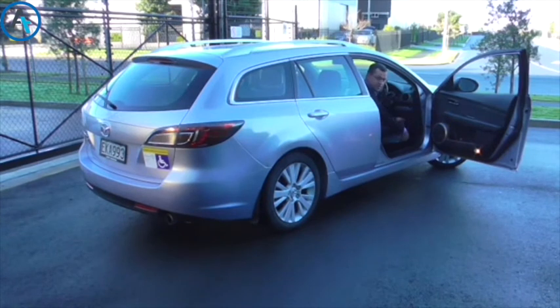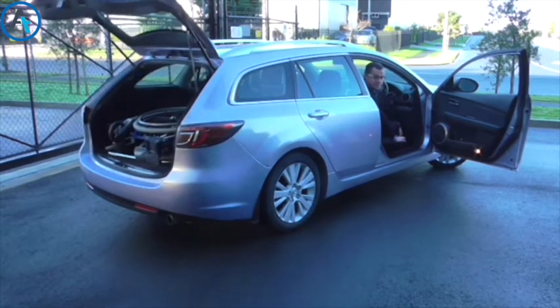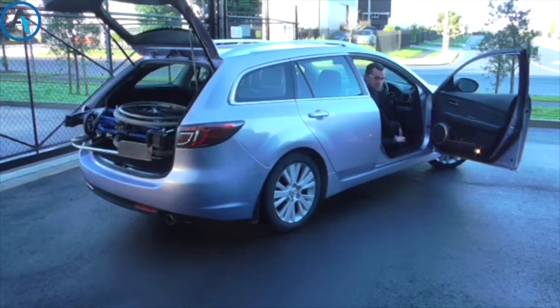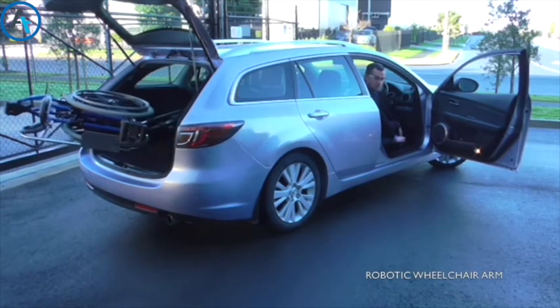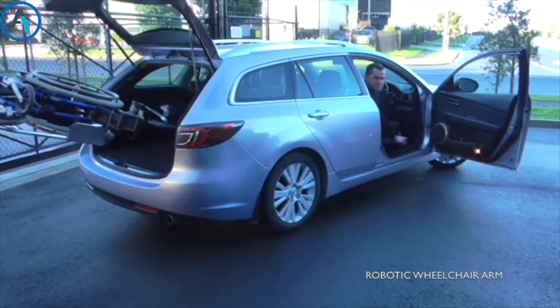Let's have a look at how it all works. First of all, we fold down the transfer to the base from the seat to the wheelchair. Then I press the up button. The boot opens automatically. Then my robot brings my wheelchair round to the door.